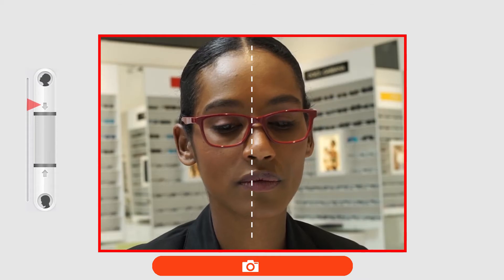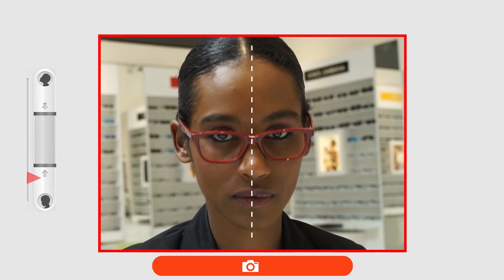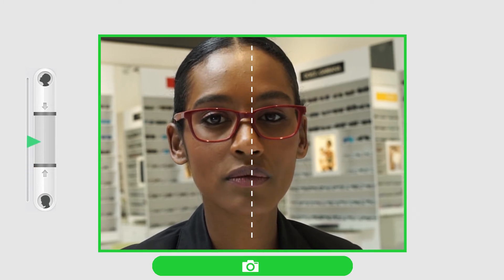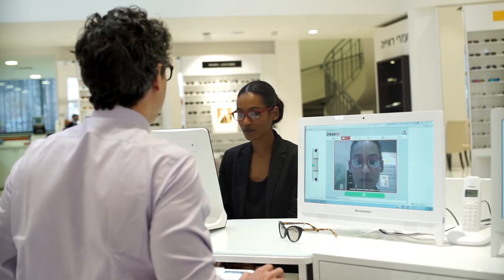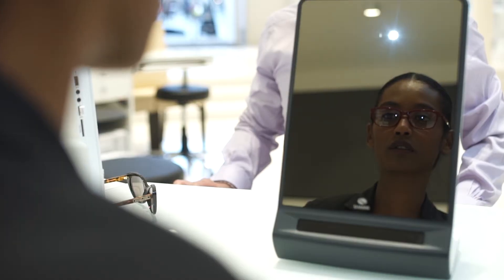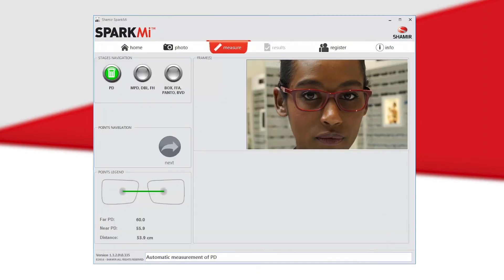The patient should be looking into the mirror while focusing on the bridge of the frame. Instruct the patient to raise or lower their head until the indicator arrow enters the area where it turns green. Once the indicator arrow and camera button are green, the picture can be taken. Be sure that the image on your screen is clear and focused, then click. There is only one picture to take with the Spark Me.